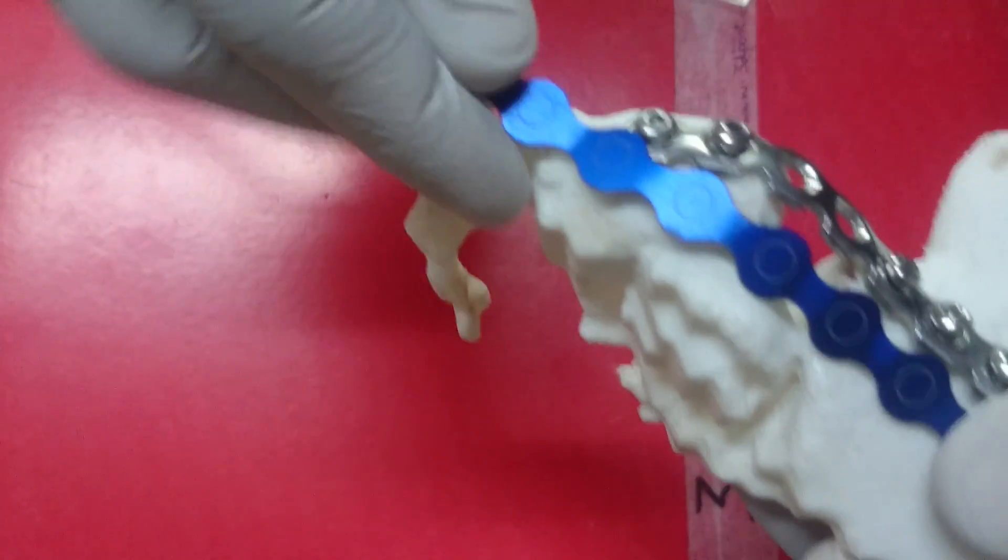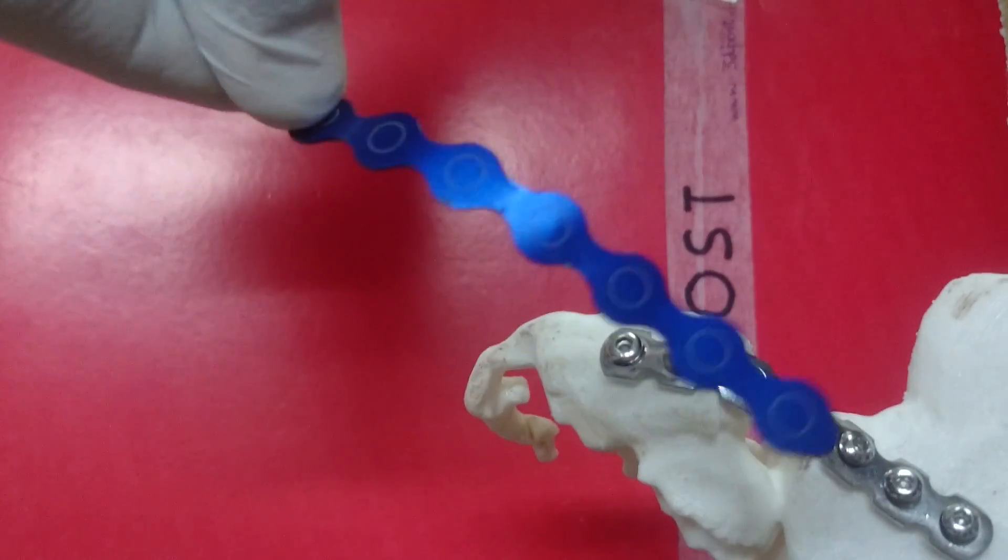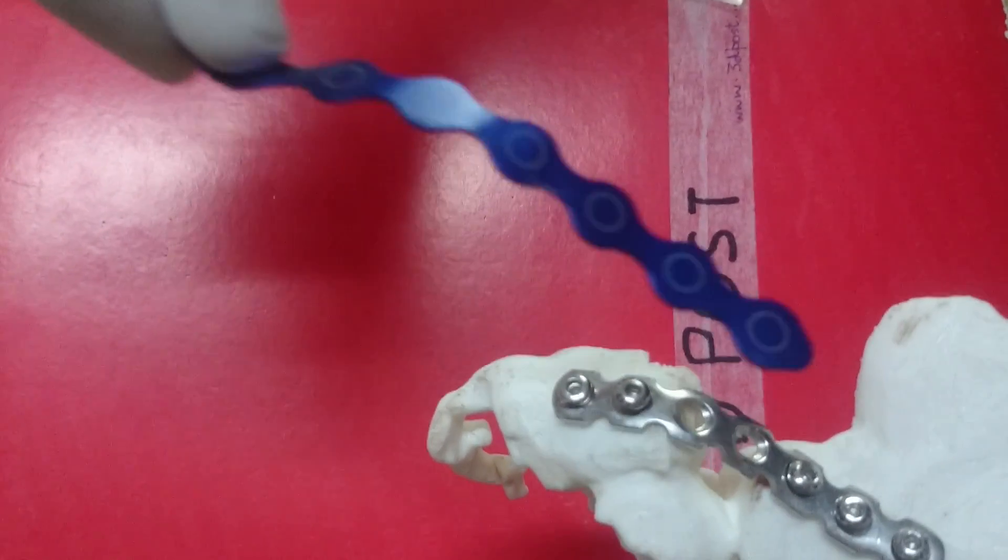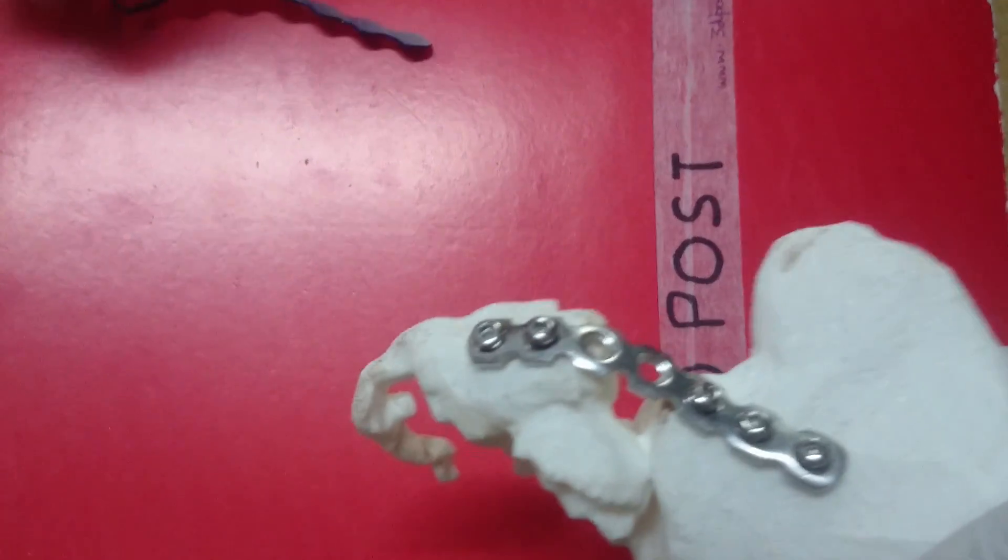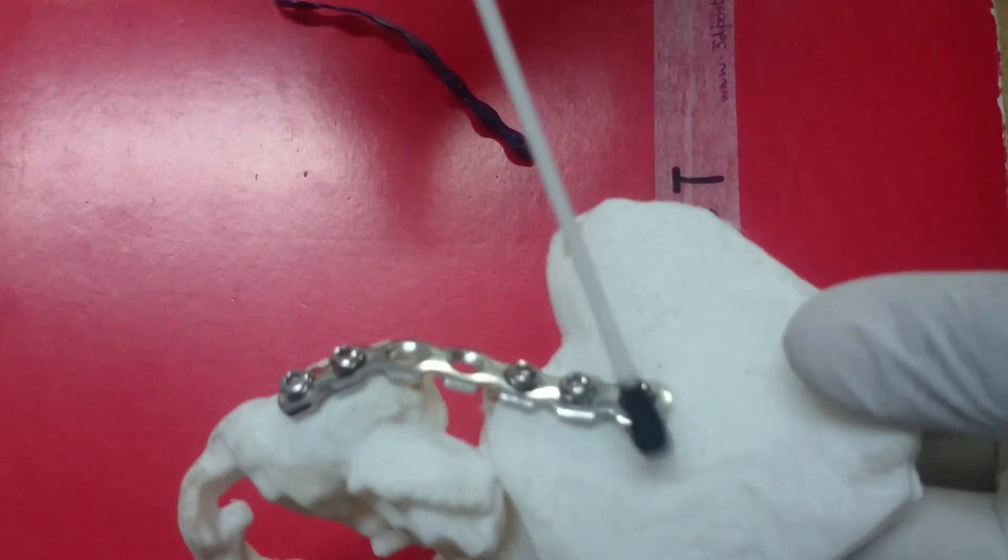The surgeon can place the template here and do a pre-contouring of his plate in this fashion. Once that is done, the actual implant can also be molded. And once that's done, the screw trajectories can be planned.